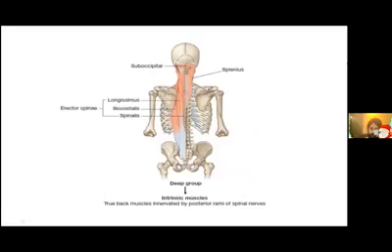This is basically the deeper muscles, which comprise mainly the erector spinae. Now, as you can see in the slide, the erector spinae is a big muscle which comprises three fibers. That is the longissimus, the iliocostalis, and the spinalis, and it runs almost from C2 downward to almost the sacral region. So we can see the spinalis muscle, which is much more medial than the longissimus and the iliocostalis. And they are seen in vertical distribution.